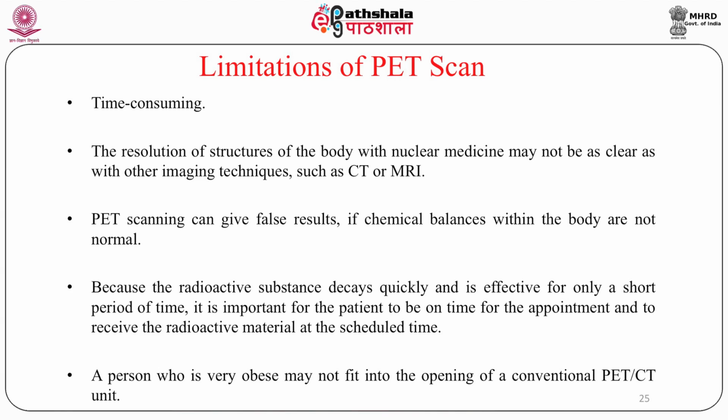Because the radioactive substance decays quickly and is effective for only a short period of time, it is important for the patient to be on time for the appointment and to receive the radioactive material at the scheduled time. The reason the patient has to be there.